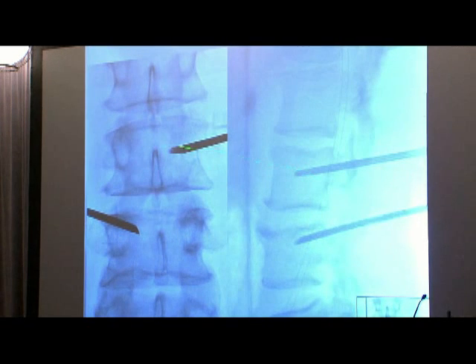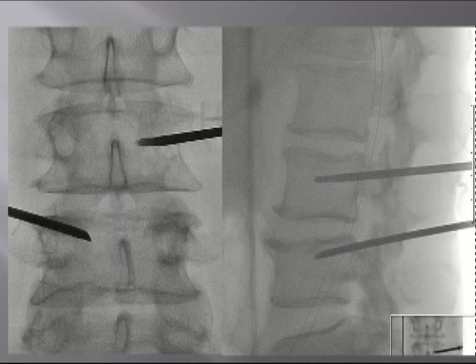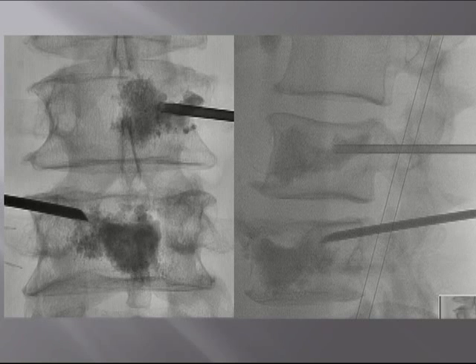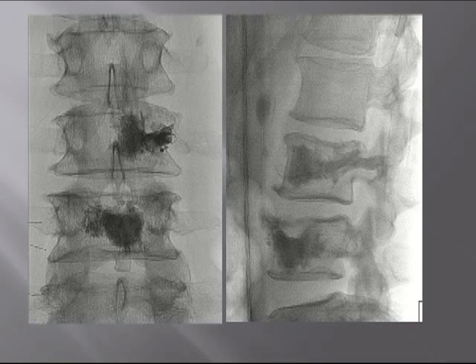In these cases, we try to start from the normal side of the bone, anchor our cement there, and let it slowly bleed into the lesion so that we can have much better control. Here you can see the cavity creator going in and making a couple of moves to make some channels, and if we can combine them, after that we start our cement and slowly let it move back. When it reaches the point where there is a crack at the end plates, we let it go a tiny bit and control it, stop there, and then pull back a little bit more, and then put cement into the pedicle, so that we fix the whole lesion with the fracture.